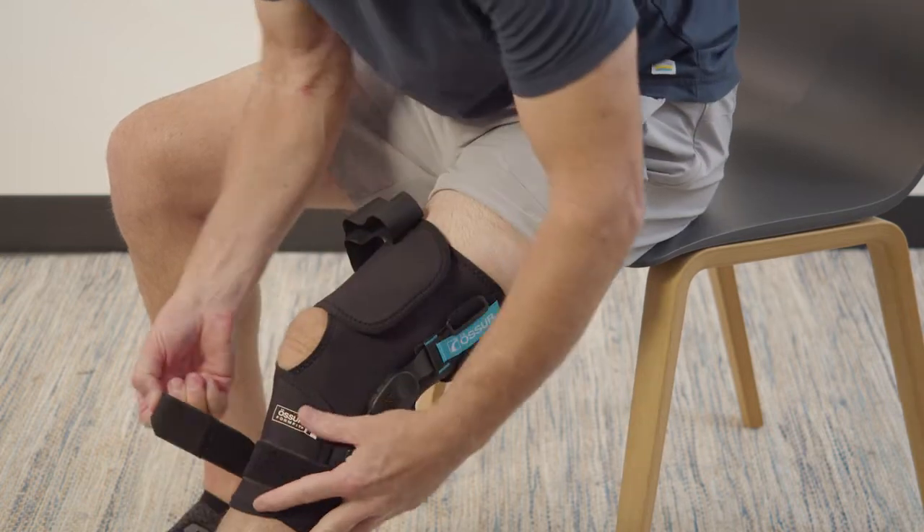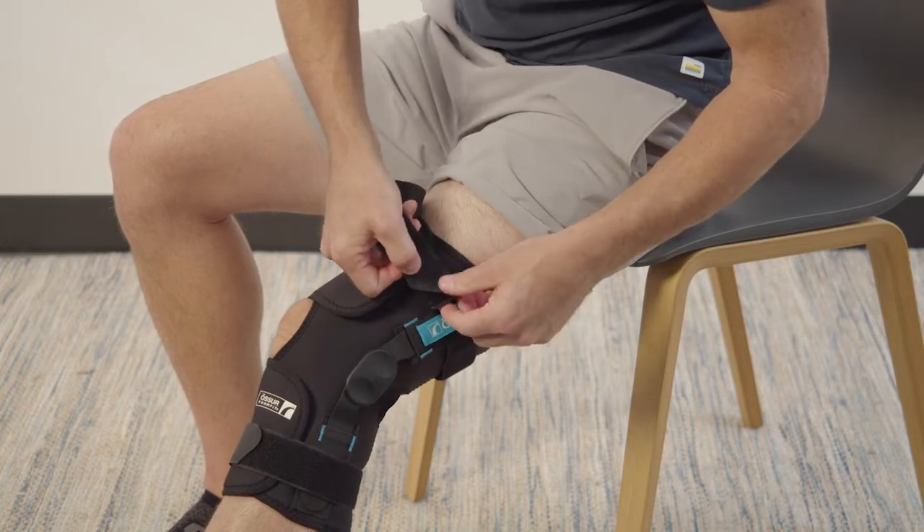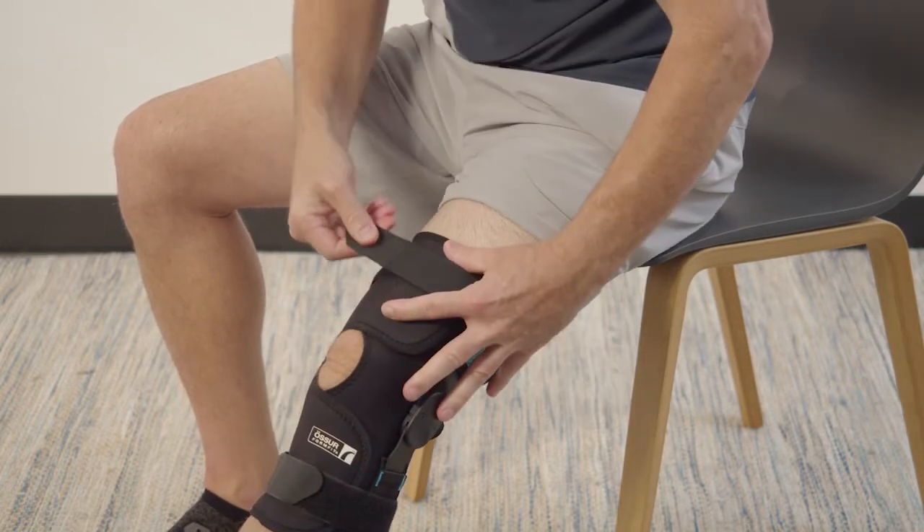The yellow strap tab allows the strap tension behind the leg to adjust to size when fitting. Once all straps are adjusted and fastened as desired, remove the yellow strap tab.